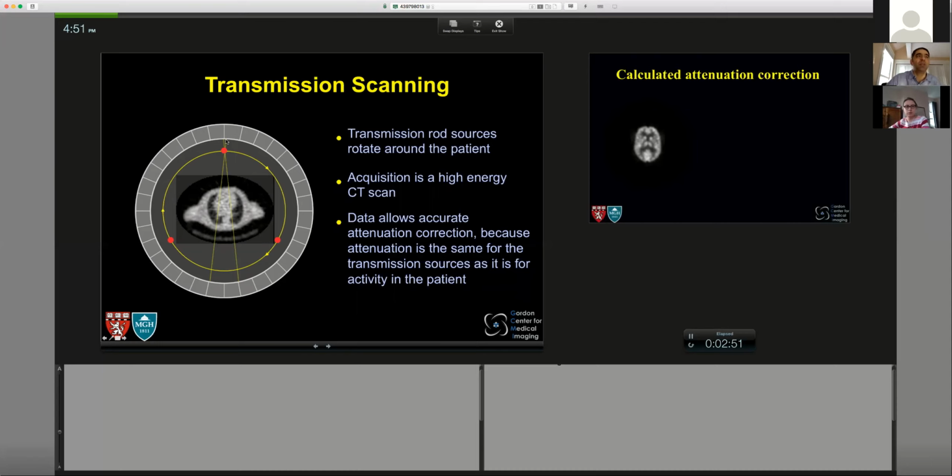So that would be the activity with no attenuation, which I would call A naught. That would be the activity with attenuation, and A would be A naught times e^(-mu x). I know A naught, I measure it here. I know A, I measure it here. And that's e^(-mu x), therefore I can calculate the mu x that I have here and the thickness that I have. So that makes it pretty simple.